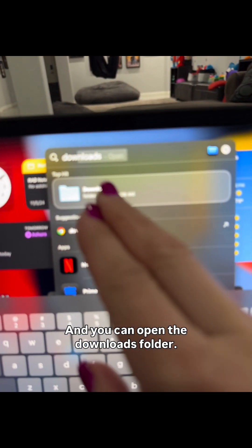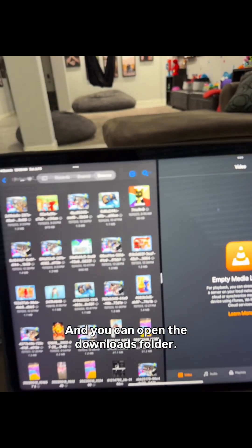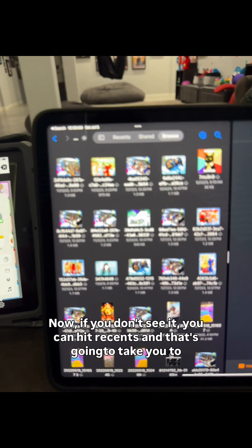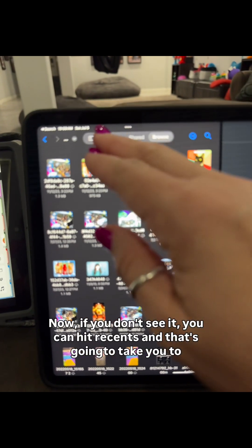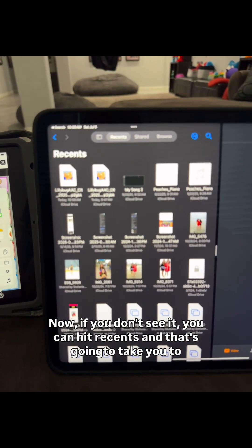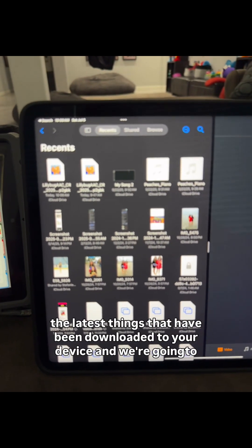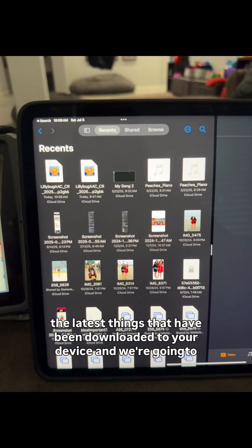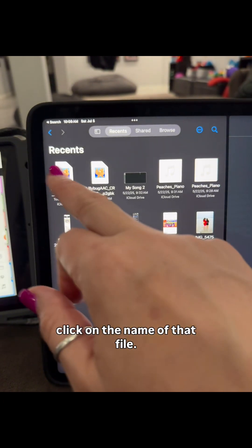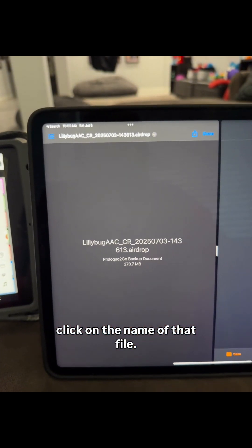Or you can just pull down on the screen and type in the word Downloads — you see that? — and you can open the Downloads folder. If you don't see it, you can hit Recents, and that's going to take you to the latest things that have been downloaded to your device. Then we're going to click on the name of that file.